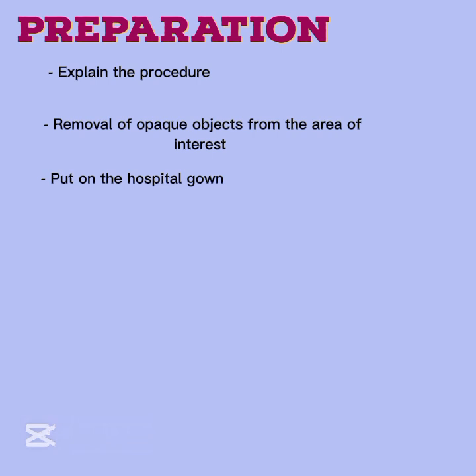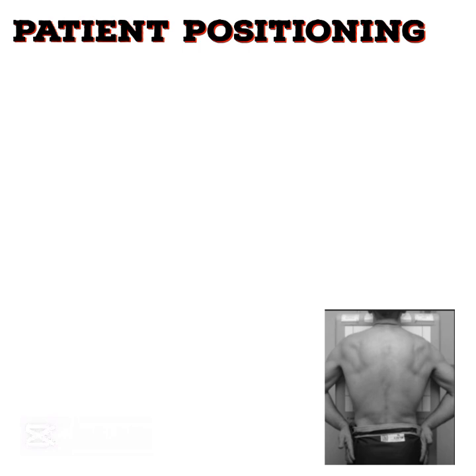Now, after the necessary preparations, you move to patient positioning. As we know, positioning is a very important aspect of imaging, because for you to get a proper image or a proper radiograph, positioning is what will determine it.